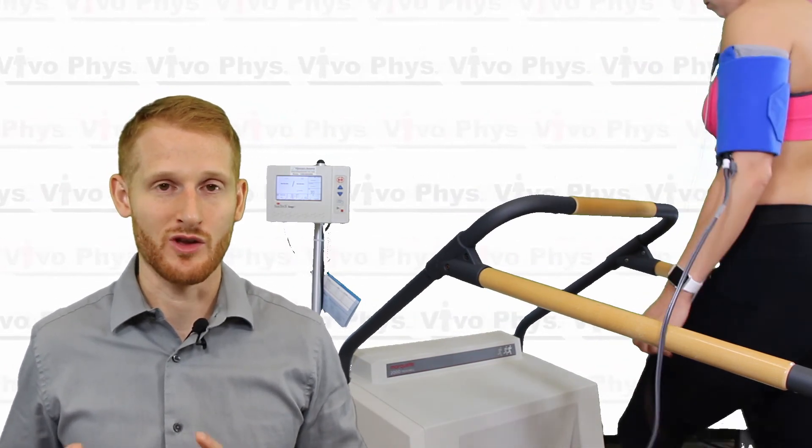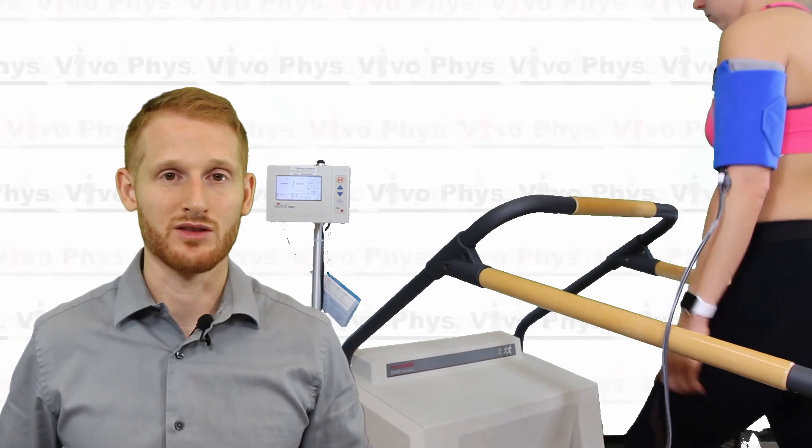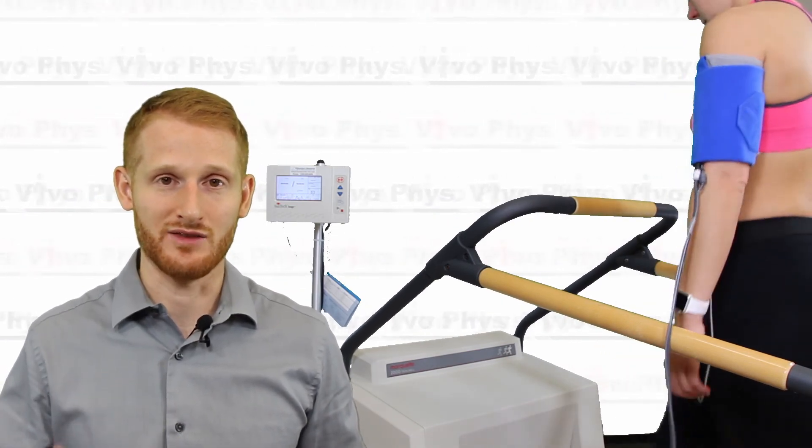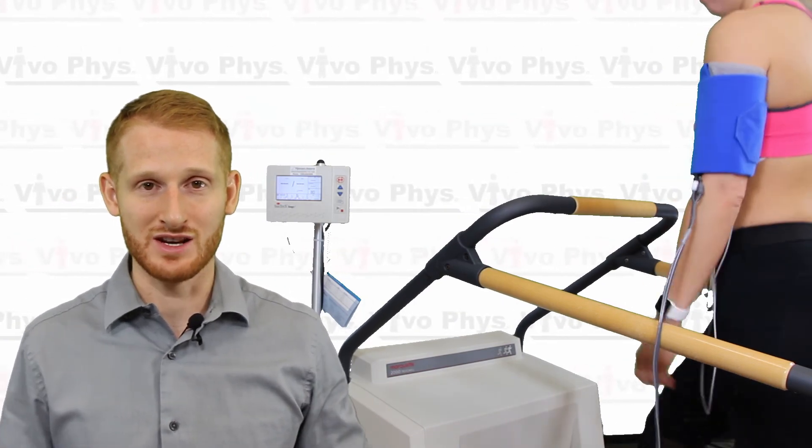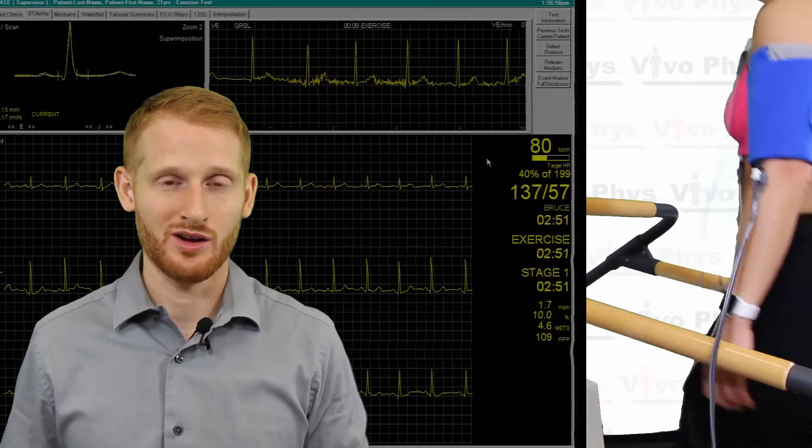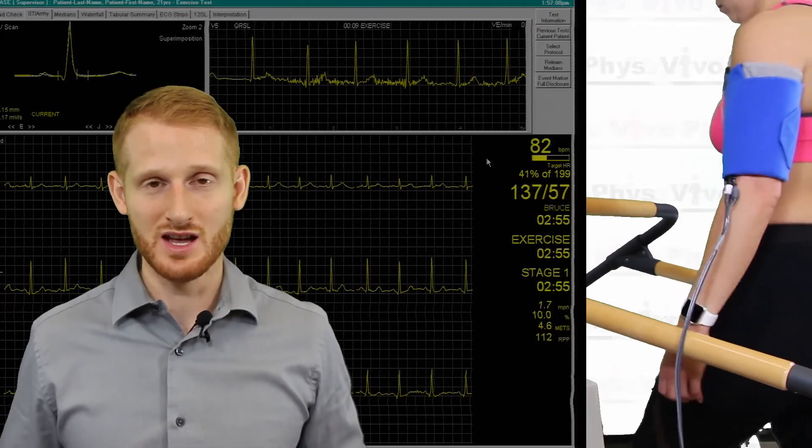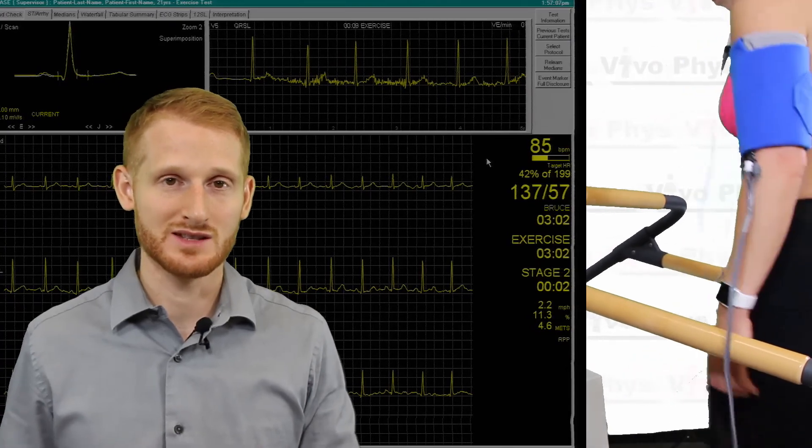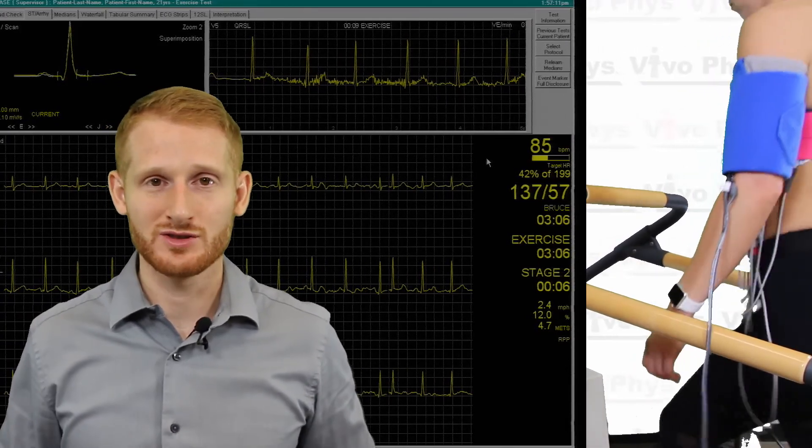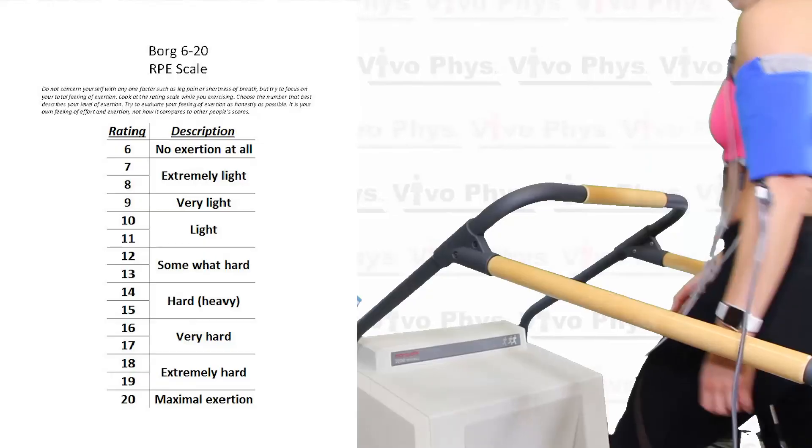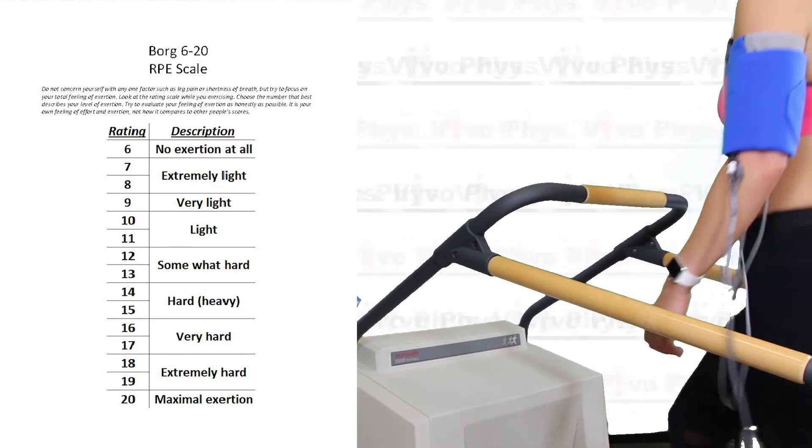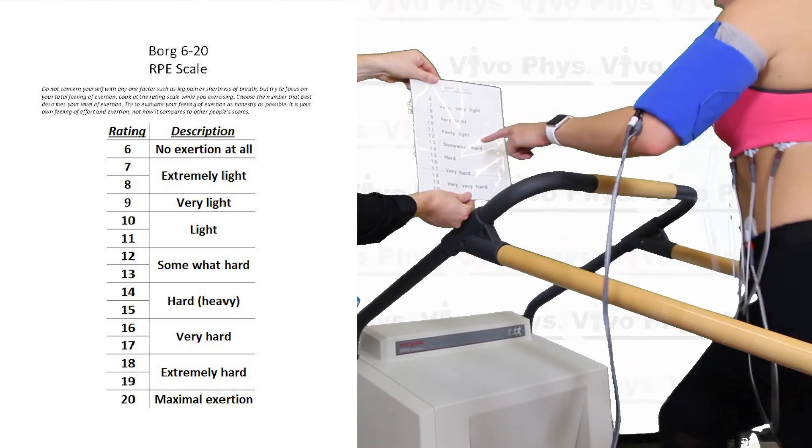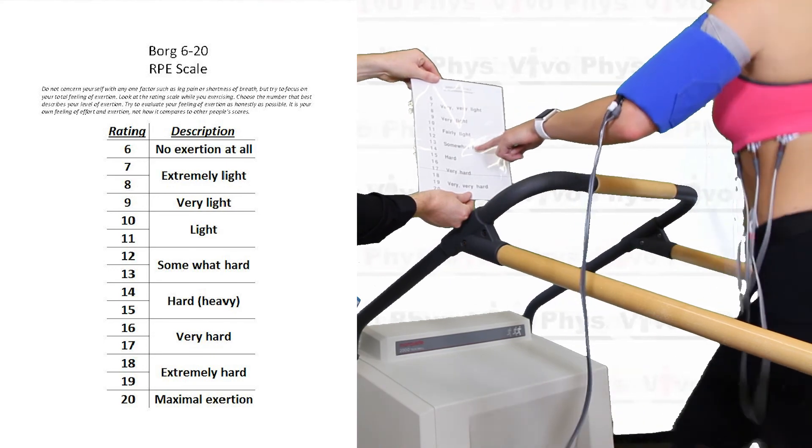This system is set to run the protocol essentially on its own. So every three minutes, the Bruce protocol gets faster and steeper. You're going to see the treadmill going up in grade and getting faster. It does that all automatically because the treadmill is integrated into the software. It also should print off a 10 second 12-lead ECG at the end of every stage. So you're going to see about five seconds before it switches to the next stage, it starts to print and it continues printing for five seconds after it switches. Some other things you're probably going to want to record would be the RPE or ratings of perceived exertion, and you're going to want to get that somewhere around this end of stage period as well.